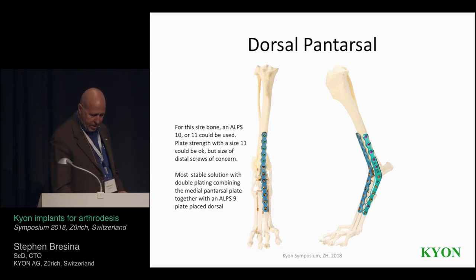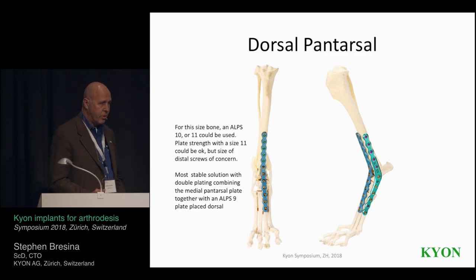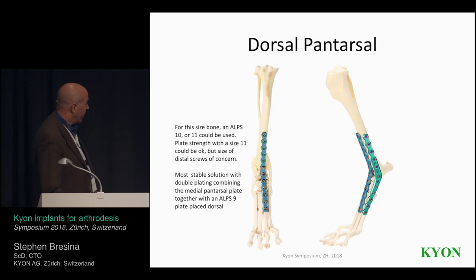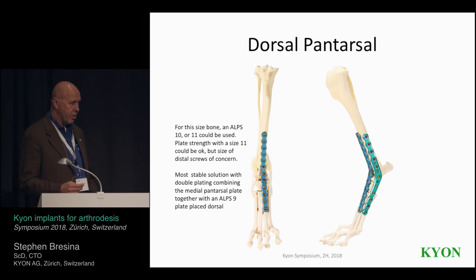So this is the indication on the pantarsal here, where we thought, okay, first we could just do a dorsal plating. And to do just a dorsal plating, you need something like an ALPS 11 to have enough strength in the plate. And if you use an ALPS 11, then you're looking at 4.0 locking screws or 2.7 cortical screws for the distal metatarsal. And we just feel that that's too large of a screw into the metatarsal. So what is going to be taught now is that a really cast-free system would start with first a medial plate and then complement that with a smaller ALPS plate. So we would use something like an ALPS 9 plate where you could then use either a locking 3.2 screw distally or even a 2.4 cortical screw.